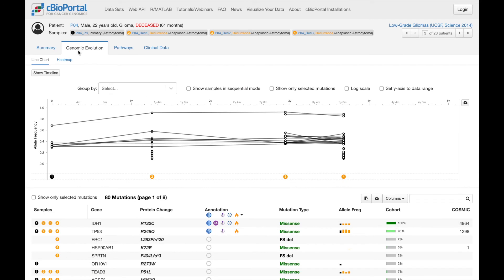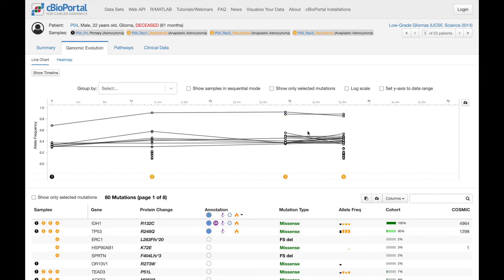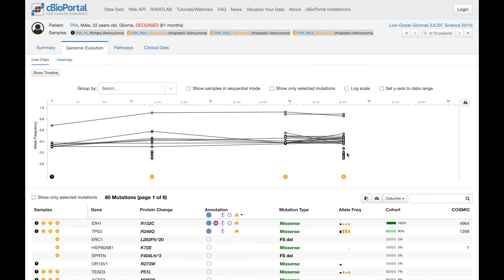The genomic evolution tab provides two distinct visualizations based around mutational allele frequencies. First, this line chart, where each line and dot represent a specific mutation and its allele frequency in a given sample. We can see mutations shared across all samples, mutations present in only a subset of samples, and others like these unconnected dots, which are only detected in a single sample.